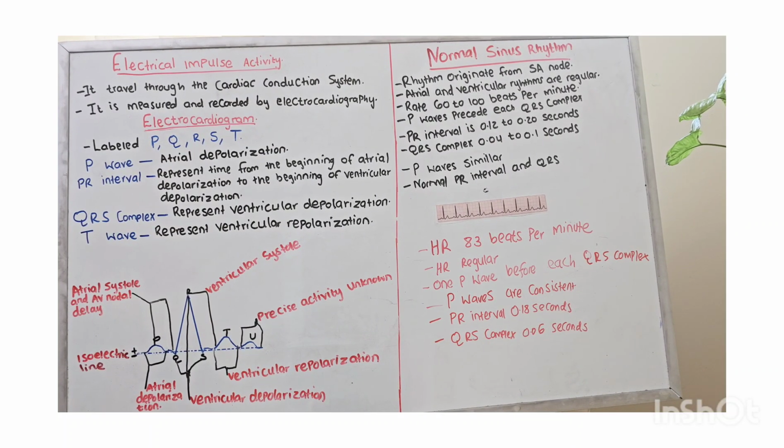My name is Tuta Aki, and today we are going to talk about electrical impulse activity. It travels through the cardiac conduction system. It is measured and recorded by electrocardiography. Let's talk about electrocardiogram.